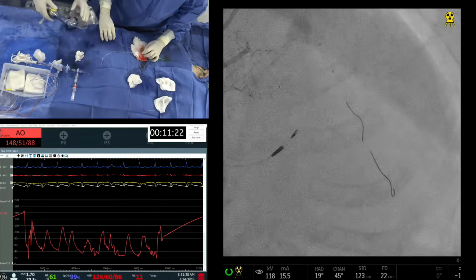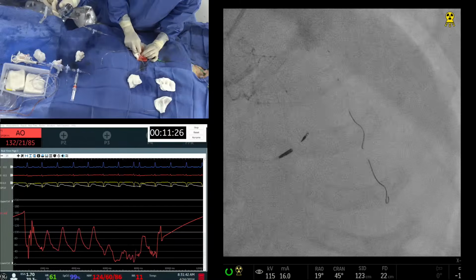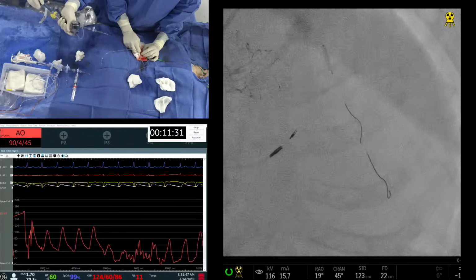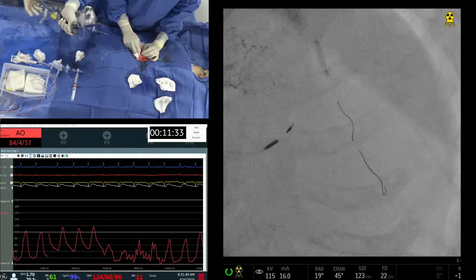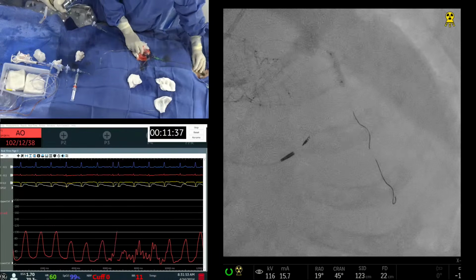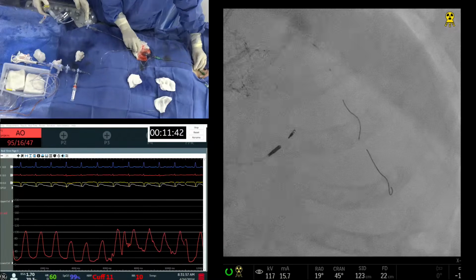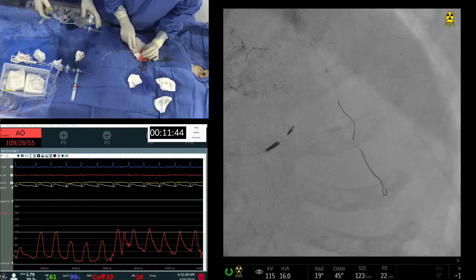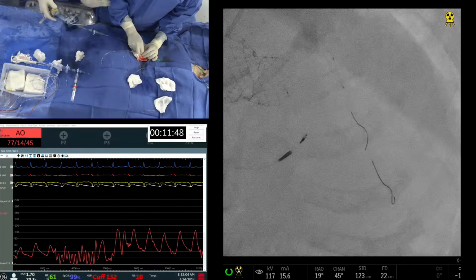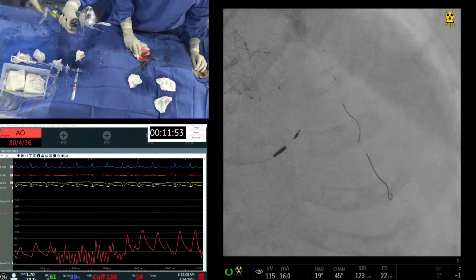I think if we let's do here, otherwise a 3.0 cutting balloon will be good enough. First, you have to go with, I think, a compliant. Okay, go up here. No, I'm saying even this one, what is happening is it's just the tail. Yeah, now it will go. Okay, down. Wait. Let me see if I can engage the guide better. So when your balloon is inflated, then you advance your guide. Let's do it now again further. It's going to go. That's it. At the level of the diagonal now. Okay, now what stent do you want to use?